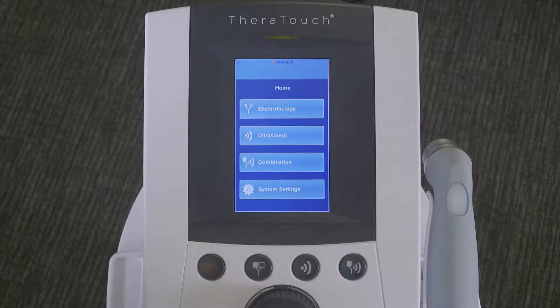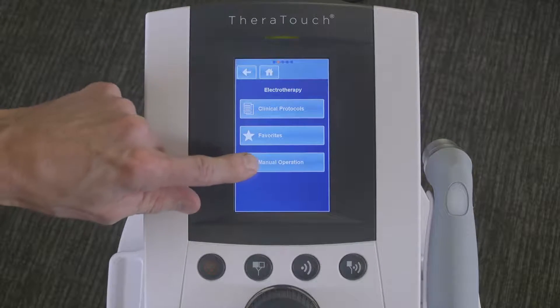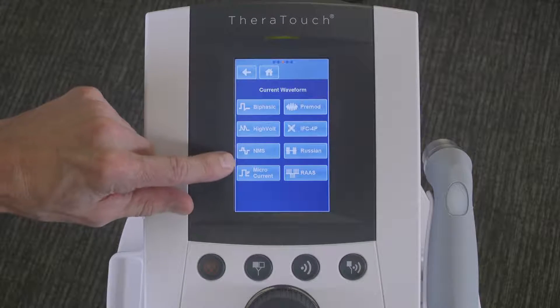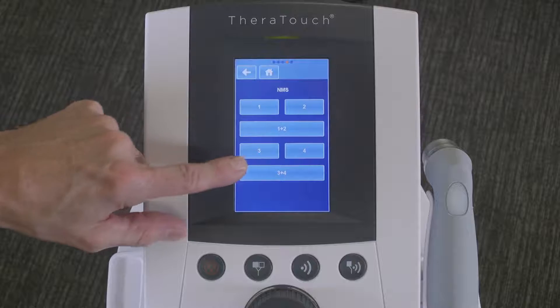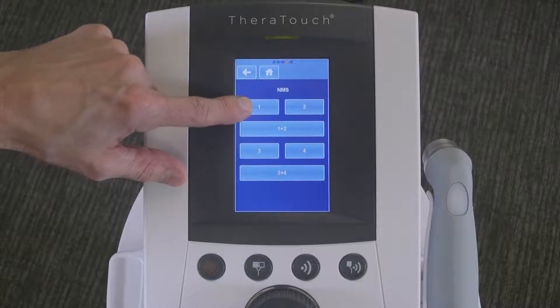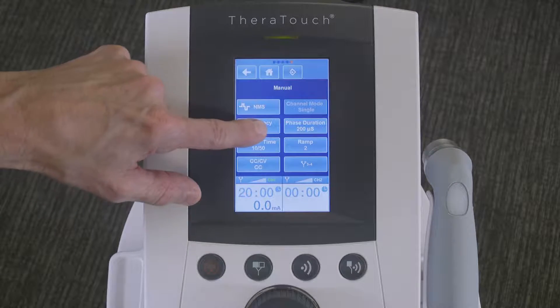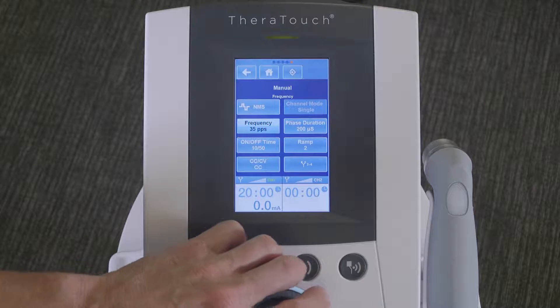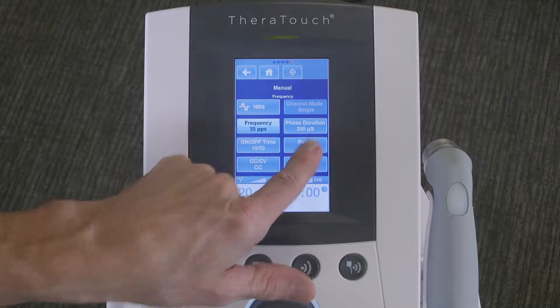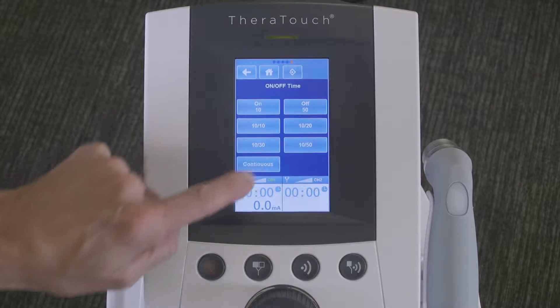To set up this protocol: select electrotherapy, manual operation, NMS, then select the appropriate channel — in this case channel 1. We want to make sure we have a frequency of 35 pulses per second, a phase duration of 200 microseconds as the default, and an on-off time set for continuous.